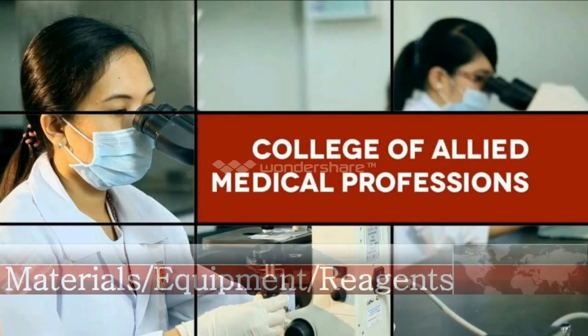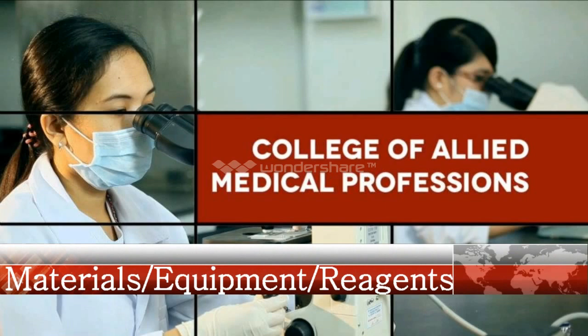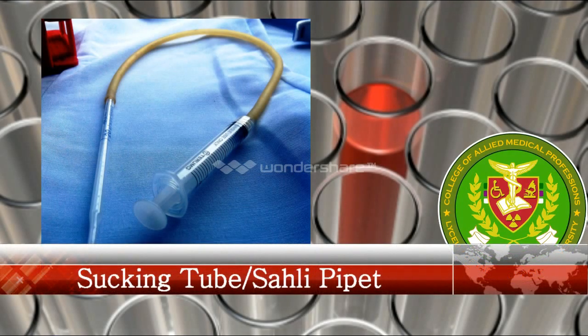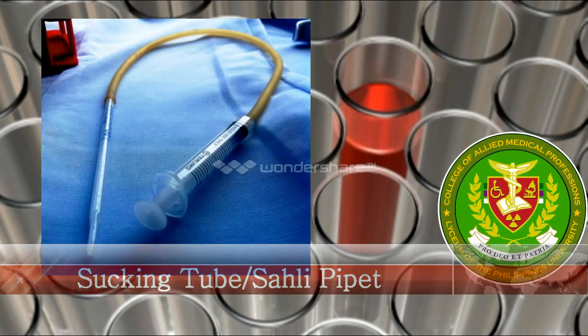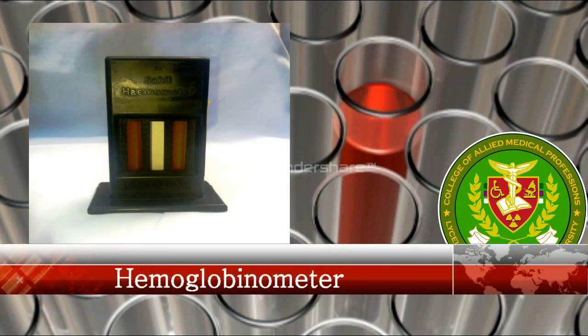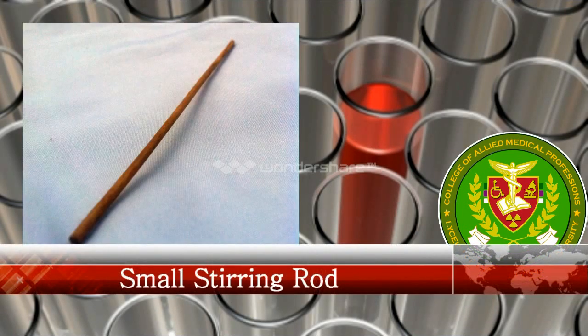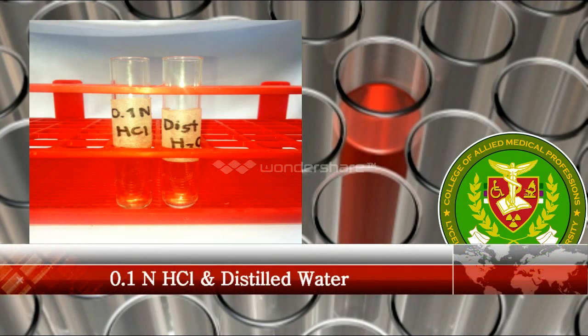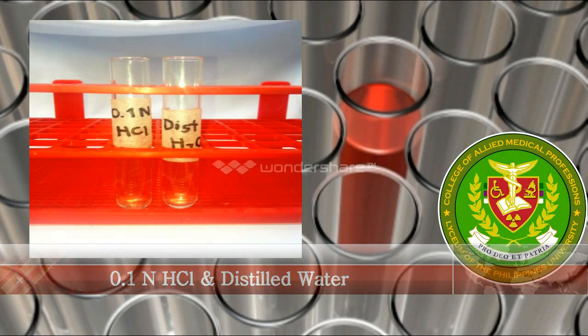Our materials and equipment, together with the reagents for this experiment, are the following: sucking tube, Sahli pipette, Sahli tube, hemoglobinometer, small stirring rod, 0.1 normal hydrochloric acid, distilled water, and a blood sample.